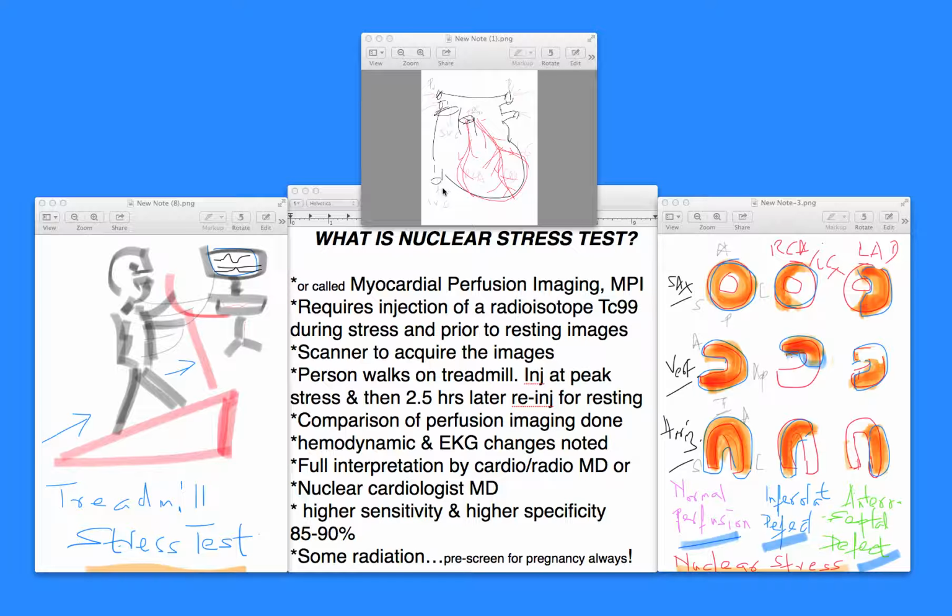How does the perfusion appear in the setting of a nuclear examination? Now, we also call it a myocardial perfusion imaging test. A nuclear stress test is also called a myocardial perfusion imaging, or MPI. Now, in short axis, for instance, the ventricle will look like a hollow of a glass, like you're looking at a donut. So obviously this becomes the anterior, this wall. This is your lateral wall. This is your posterior wall or inferior wall, and this is your septal wall.